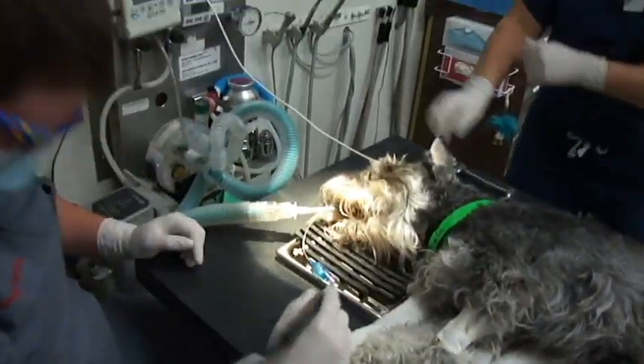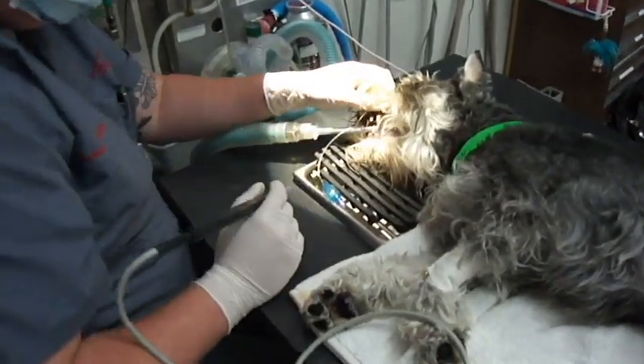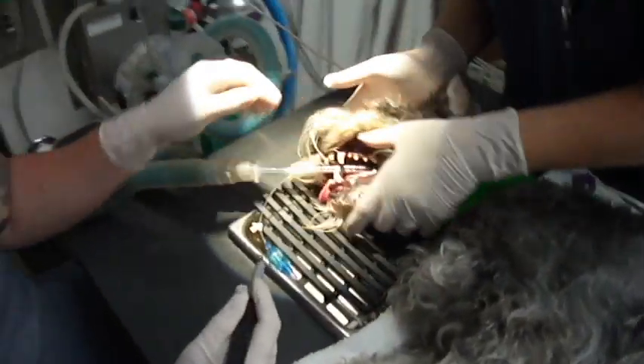I'm so glad I didn't have to tell you — the first thing you do is the oral exam. Alright, we'll try to get some of this.